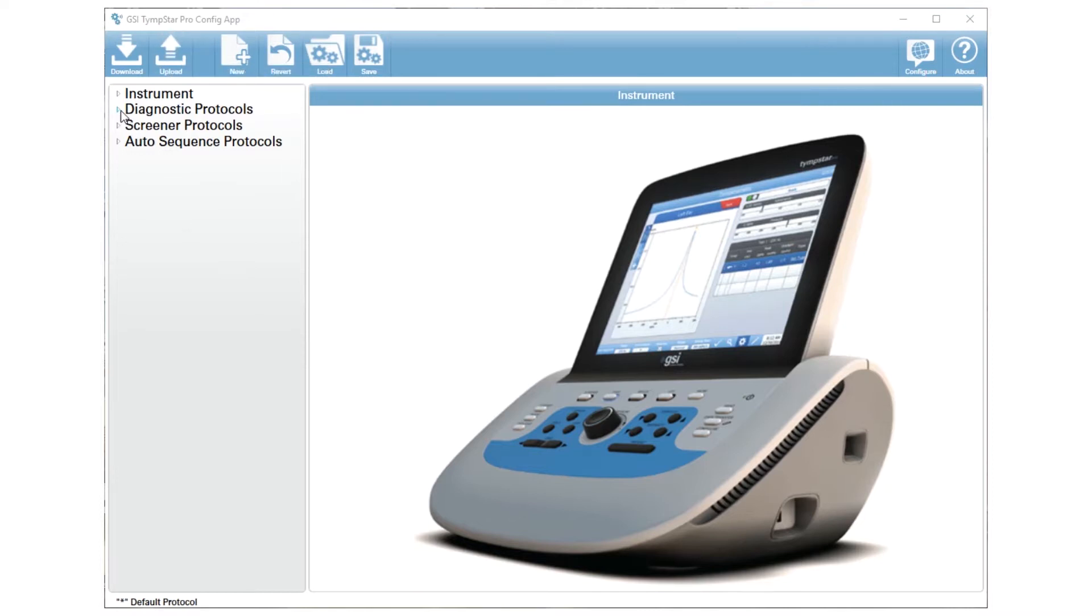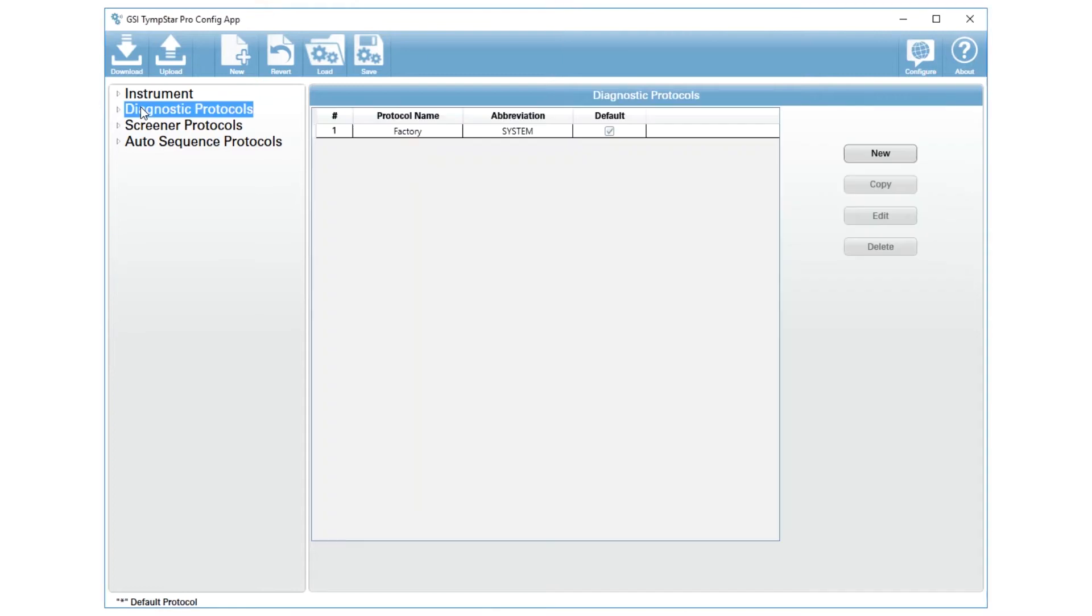The next thing you'll do is go to the diagnostic protocols, which is where the protocols can be found. We have one protocol that is set, called the factory or system protocol, and it cannot be edited.